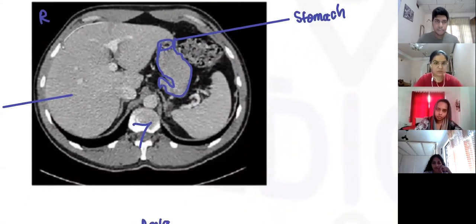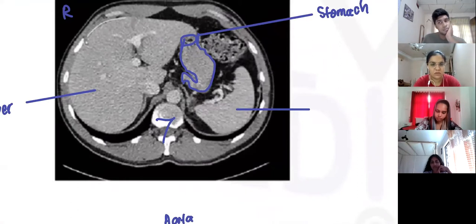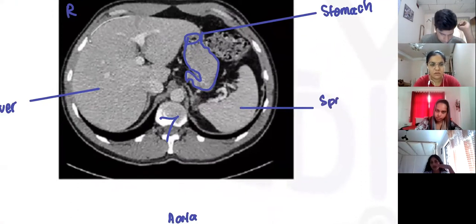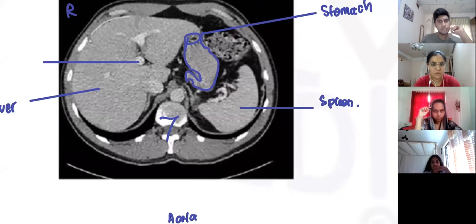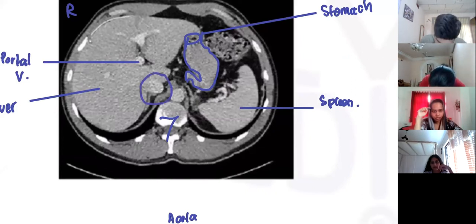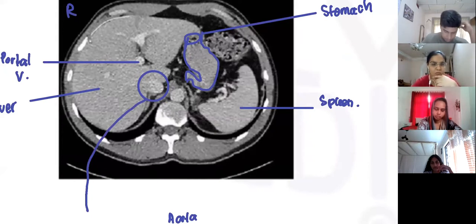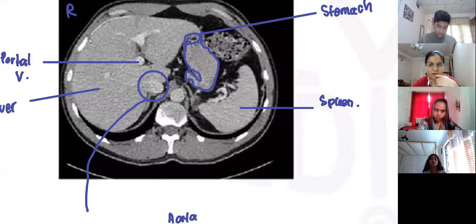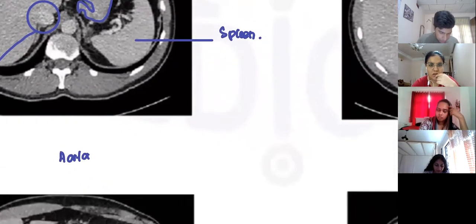There's T1 imaging and T2 imaging, but for now just try to understand this. What do you think this is on the left side? Spleen. Now can someone tell me what this is hidden inside the liver? Portal vein. Then there's one more structure which is a bit brighter than the others, to the right of the abdominal aorta. What do you think this is? Inferior vena cava.